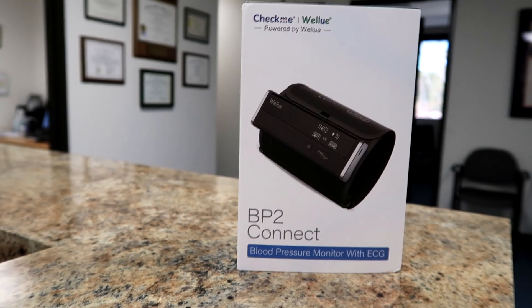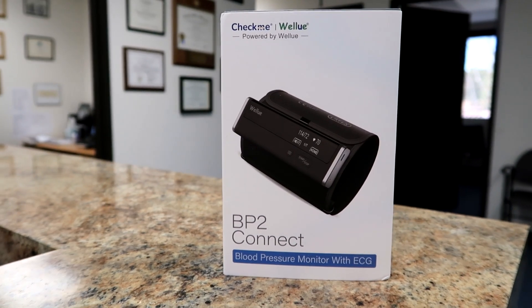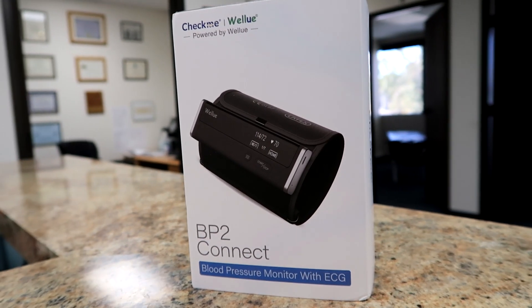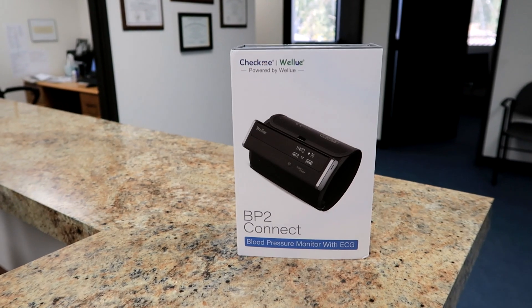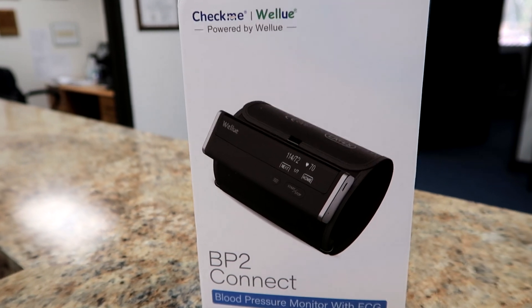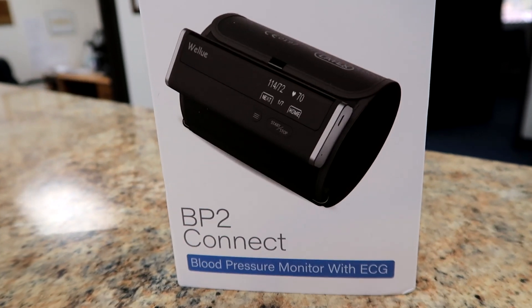This is a product. It is the BP2 Connect blood pressure monitor with an EKG. It does not help you with concussions. My editor pointed out I pronounced it wrong — I said BB2, but it's BP2. BP2 Connect. Blood pressure 2 Connect — that's what it's for.